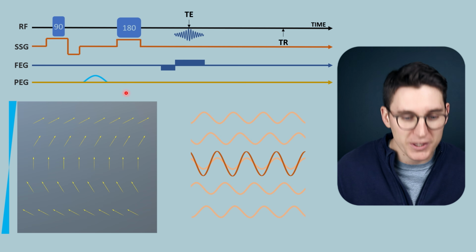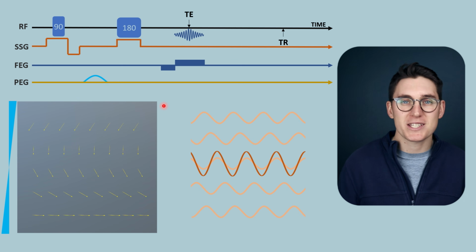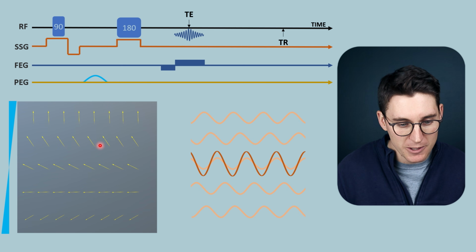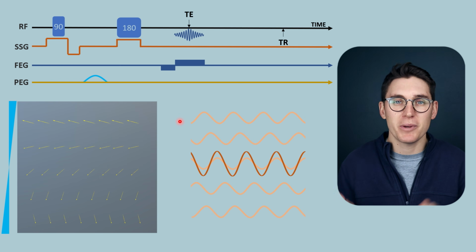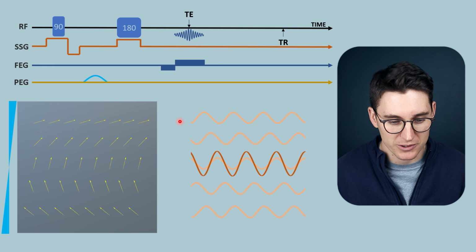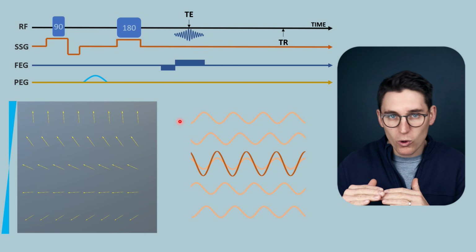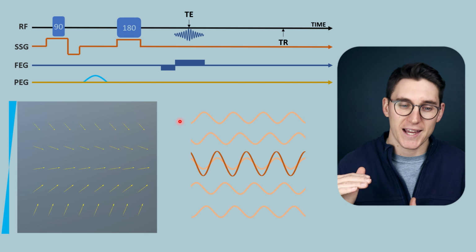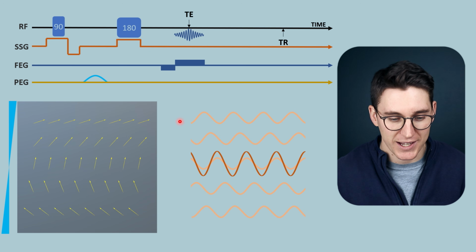Now when we stop that phase encoding gradient, the net magnetization vectors are going to precess at the same frequency no matter where they are located within the slice. They are only experiencing the B0 magnetic field. We have not got any frequency changes along the x-axis or any frequency changes along the y-axis. What we've got here is phase changes along the y-axis.